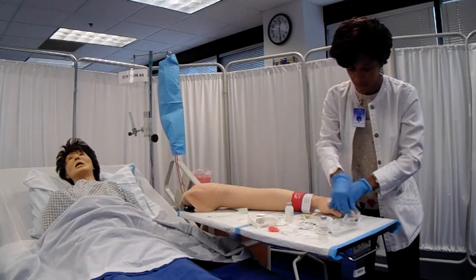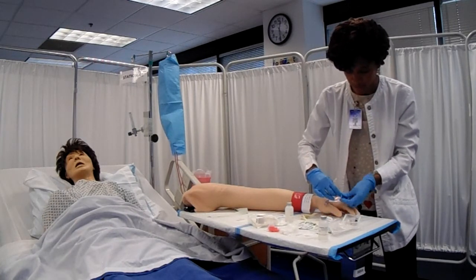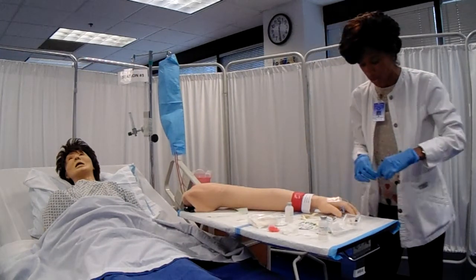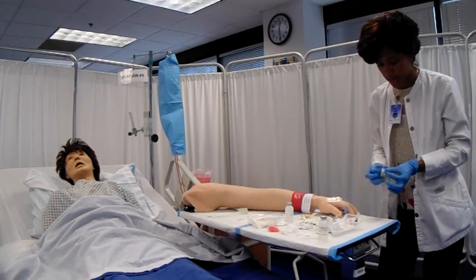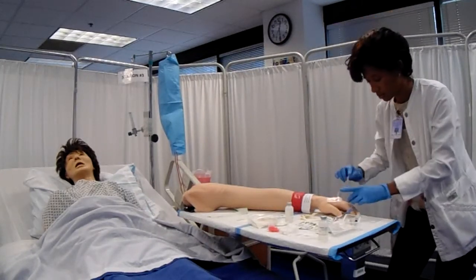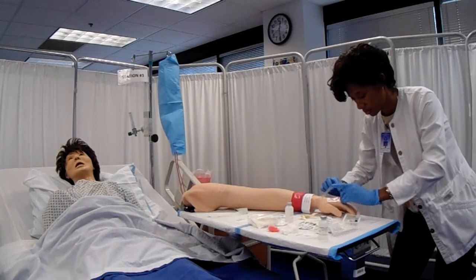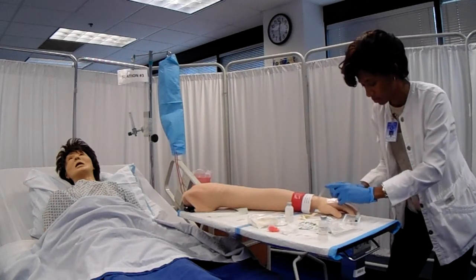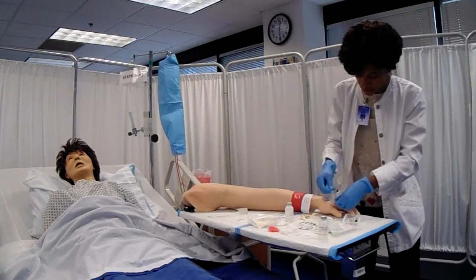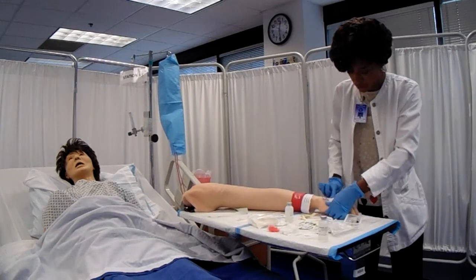I'm going to remove my flush, clamp my tubing, and then I'm going to use 2 pieces of tape to secure my line. One to anchor the hub of the tubing, and another to secure the other end.